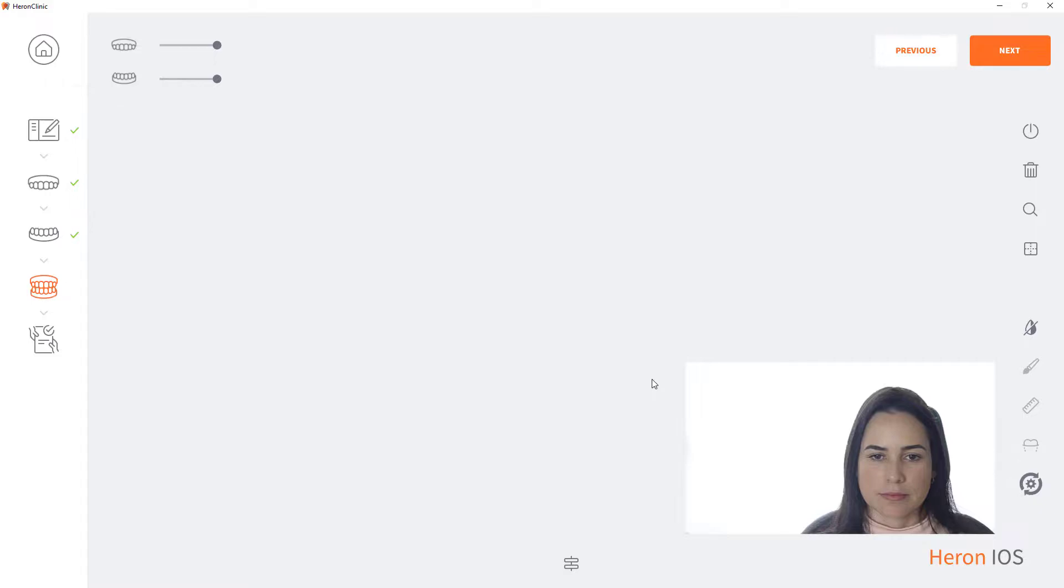Hello. Welcome to 3Disk Knowledge Center. In this video, you will learn to lock the patient's bite in the bite alignment scan step.